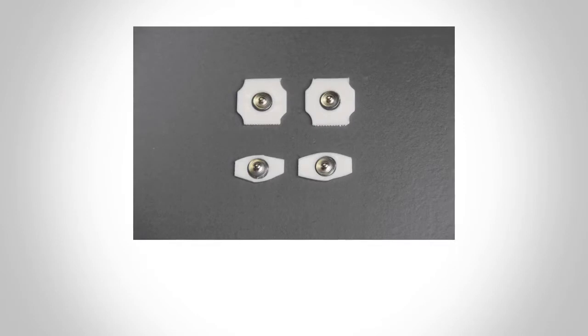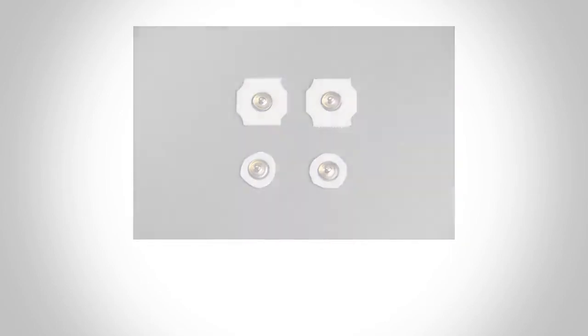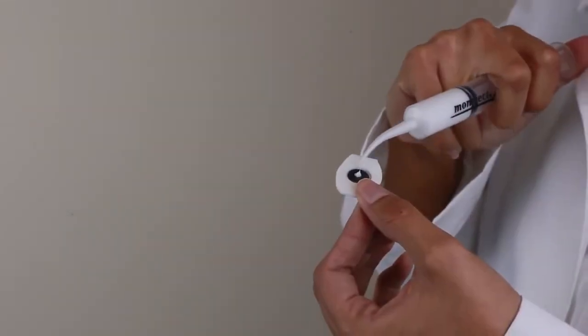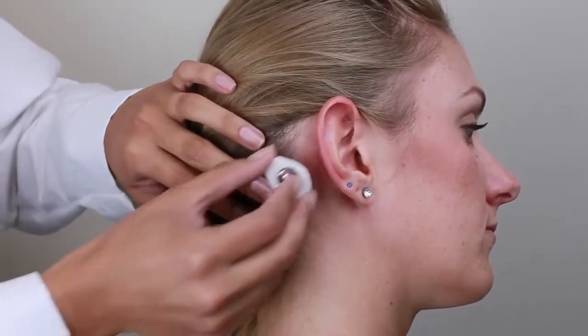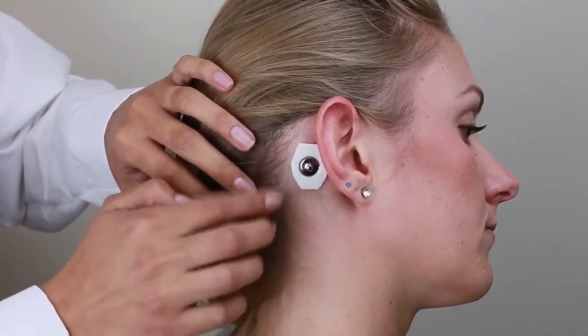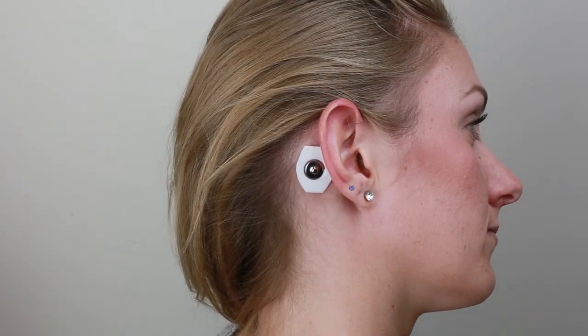For easier placement and improved participant comfort, use scissors to cut down the sides of the two adhesive mastoid electrodes. It is recommended to prepare these in advance and have them ready before the participant arrives. Peel off the paper to expose the adhesive. Apply a small dab of cream on the center of the electrode, then apply them to both mastoid bone sites. Proper mastoid placement is critical, so take care to feel for the bony area behind the ear and avoid the hair and muscle for optimal data quality and comfort. Note that the mastoid electrodes should be placed behind both ears and are not side dependent.